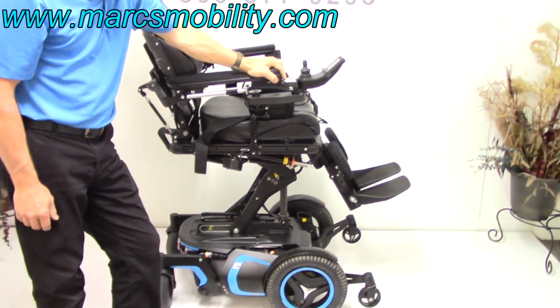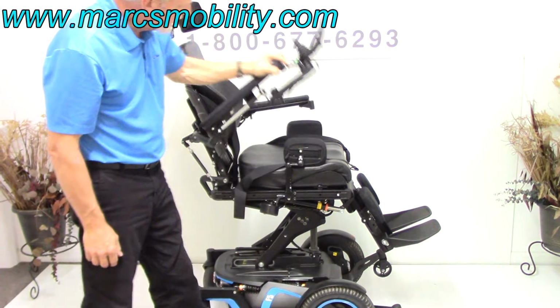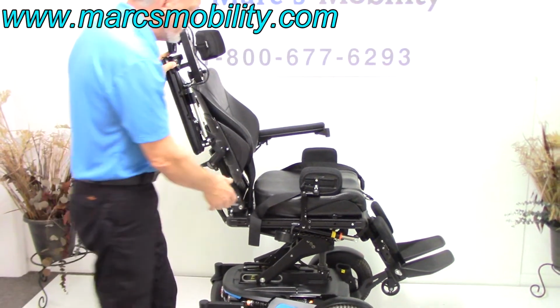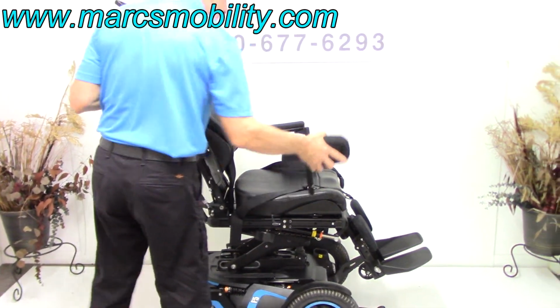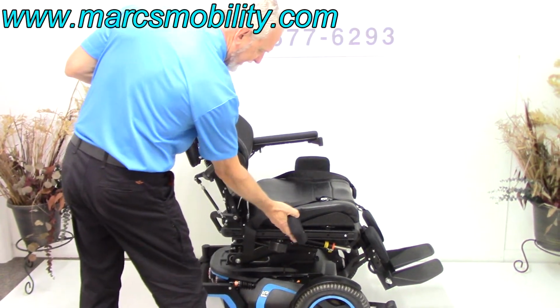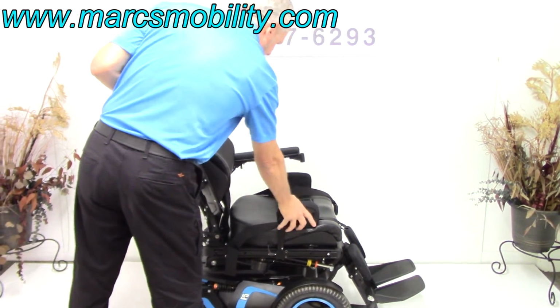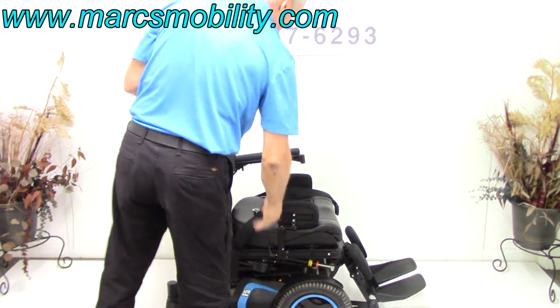So now you've got the 14-inch seat lift that I'm going to bring back down. These arms do flip up, so if you need to get in and out, you can move both arms up. These lateral pads also can be removed, and they can be moved all the way up to the front by moving this little bracket here on this track to the front. So the lateral pads are sitting quite a bit back, but that's the way this chair was set up.